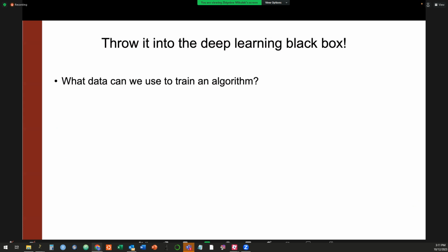Turns out that there's two problems with sort of a naive approach. One is, as I mentioned, we need a lot of training data for a deep learning algorithm. And it was hard to generate TissueNet, but it is really hard to generate manual annotations for cell clustering. It can't be the case that you get a bunch of high school students and have them circle cells, which is how we started out.